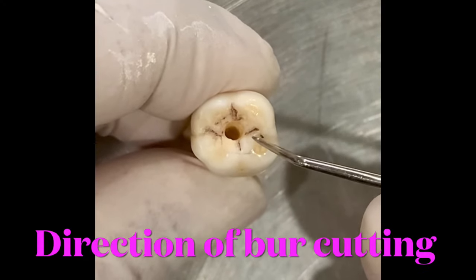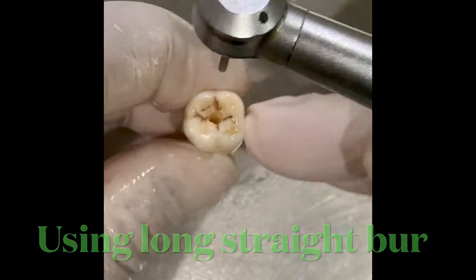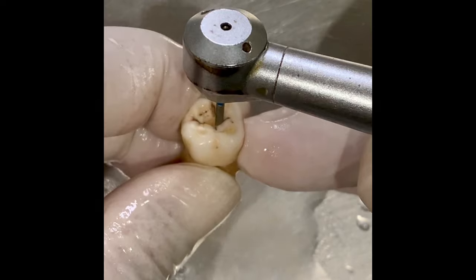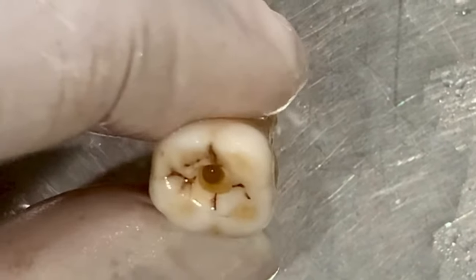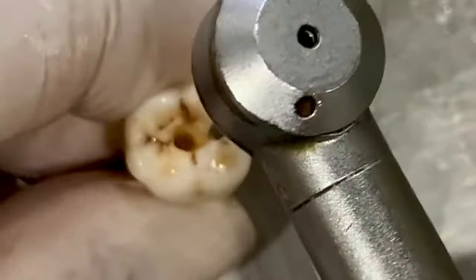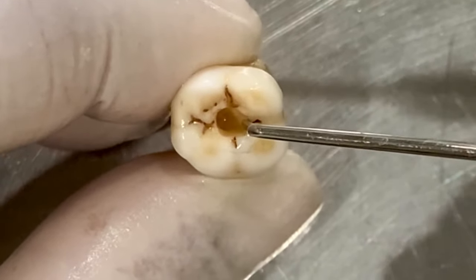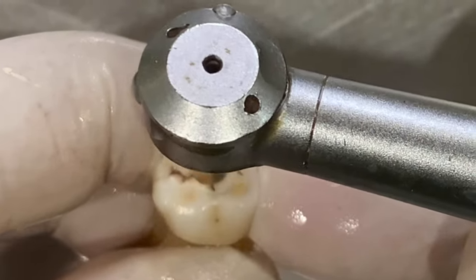Now I'll change the direction of the bur and cut towards the mesial side, and then go towards the lingual side. I'll also change the bur — instead of round I will take a long straight bur. Now you can see how we are proceeding towards the mesial direction, and now we'll move the bur more towards the lingual side.